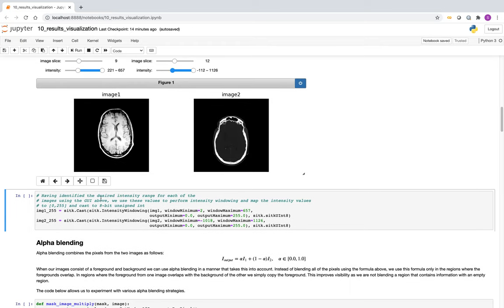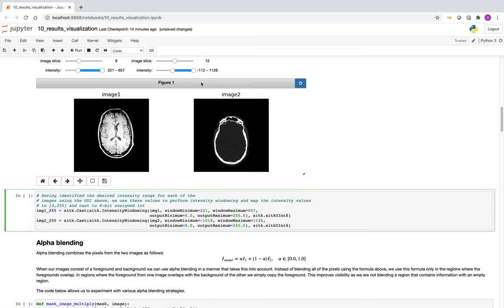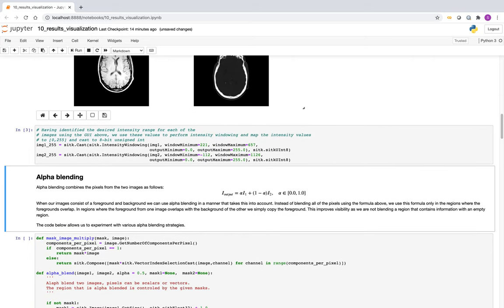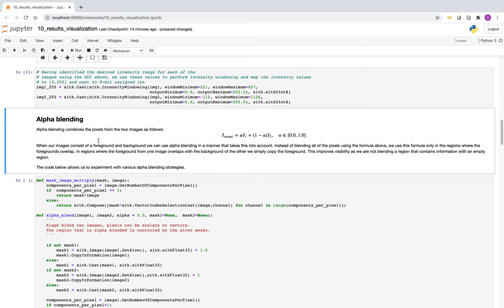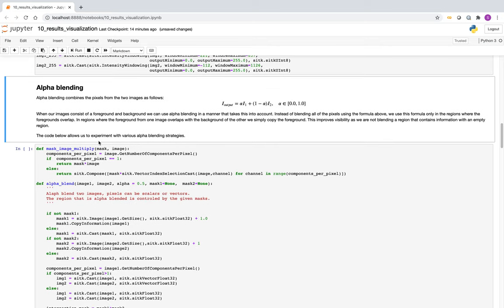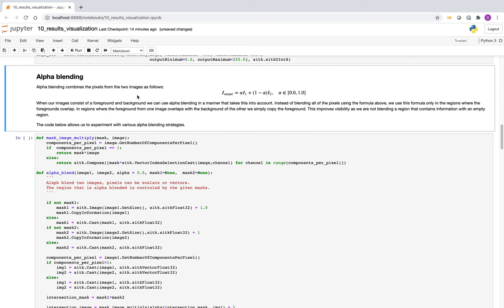So this UI allows you to play around with the dynamic range. Let's take the MR here. We're changing the dynamic range. We look, that looks okay to us. And here we have the CT. CT we'll do, we'll take this region, which essentially is the bony region. And now we've identified what is the window level and the range that we want to use. And here we can do the mapping.